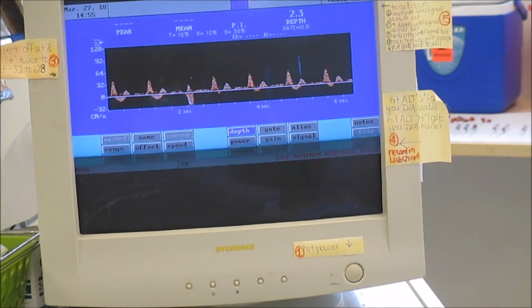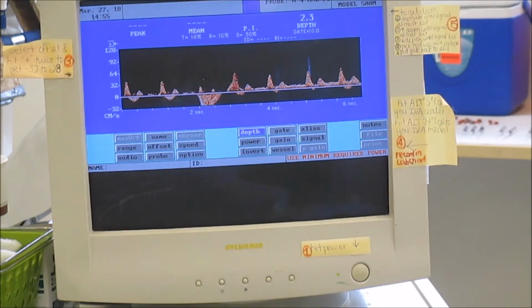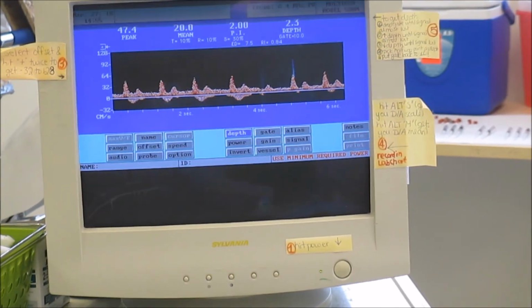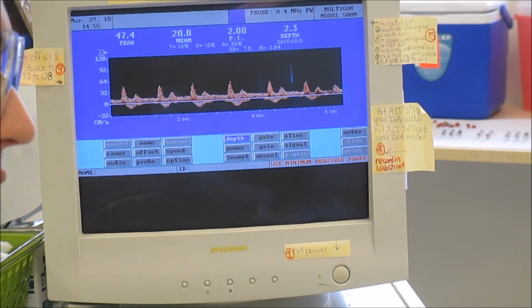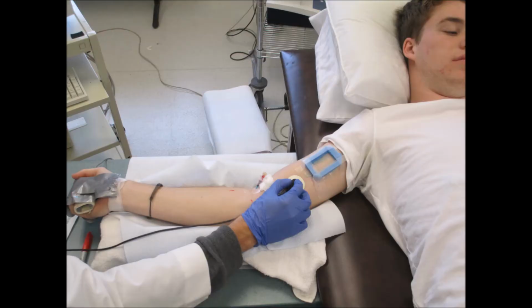Another limitation of this technique is the motion artifact noise that may affect the clarity of results. This is the blurring of reflected sound waves that may occur due to respiratory, muscular, or other movement of the subject during the protocol. This highlights the importance of finding the correct angle in which to place the probe, as it is very sensitive to motion.